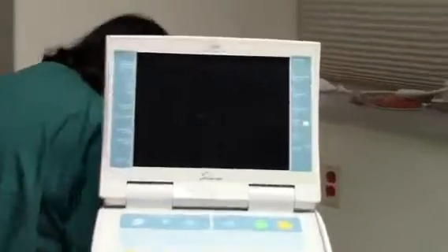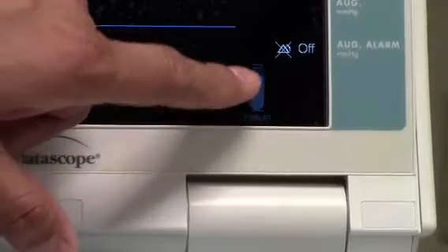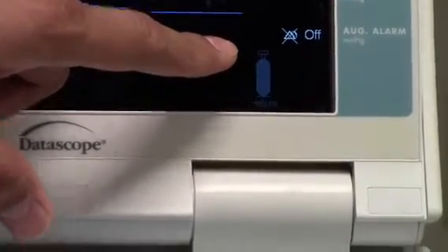Now we want to check the balloon pump to see if we placed the helium tank correctly. Turn on the balloon pump — the on/off switch is on the right. Within seconds you can hear it turn on and there will be lights on the dash. There's a tank icon on the bottom right, and you can see it shows a full tank. That concludes our demonstration — thank you for your time.